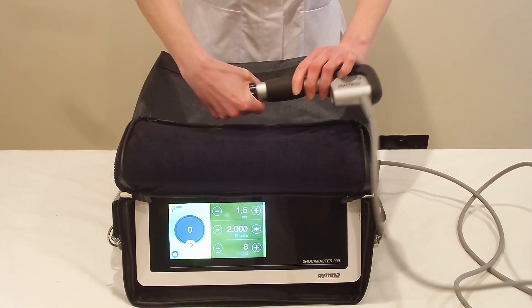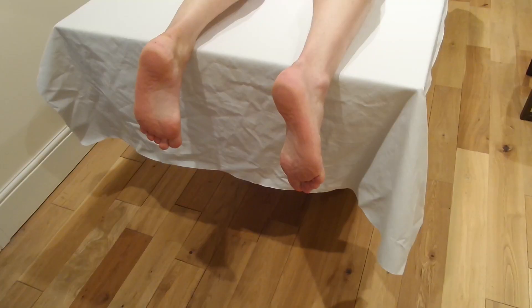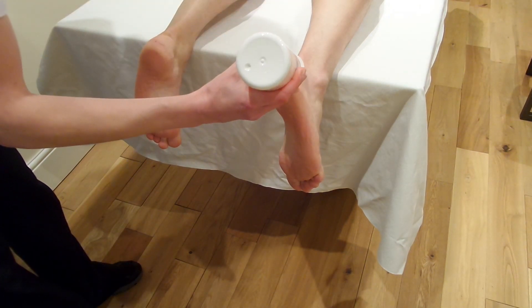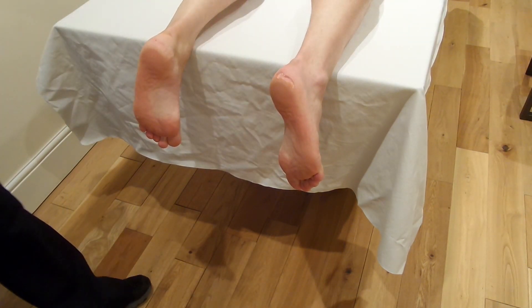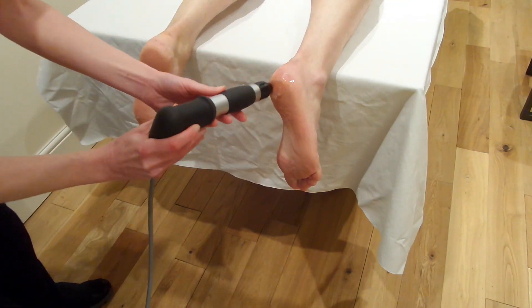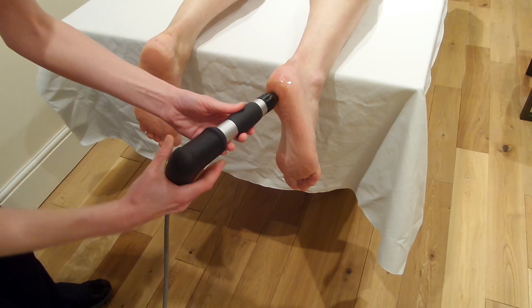Apply the head. Now we'll just apply some gel to the foot. I'm going to apply the gel a little bit high — actually apply it onto the heel just so it doesn't run off the foot. Spread the gel out.